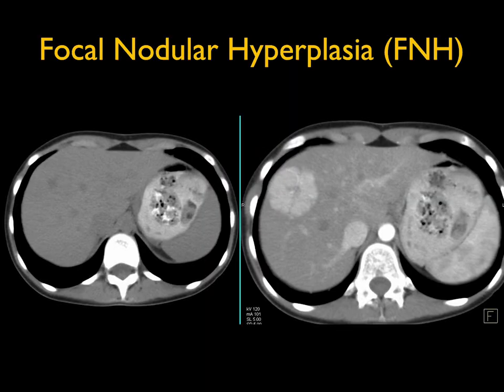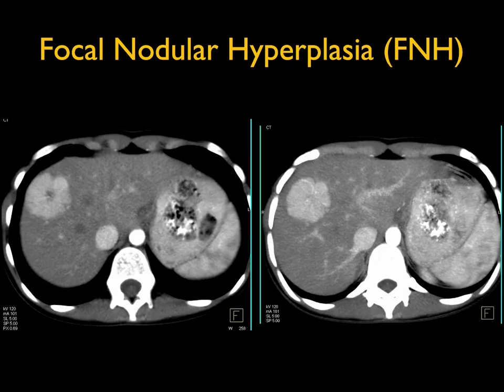Case 8: the liver looks pretty normal on non-contrast. On the arterial phase there is a vascular lesion about five centimeters with a central scar. Notably, the lesion is vascular but not as vascular as the aorta — it is only as vascular as the IVC. When I see a mass that is vascular like the IVC I'm always thinking about focal nodular hyperplasia. Hepatomas and hepatic adenomas tend to be more vascular, appearing more like the aorta.